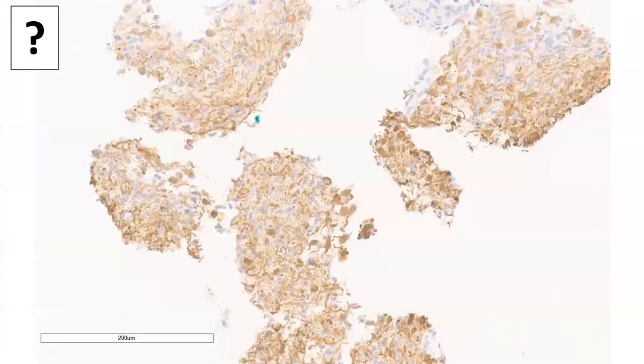Now, here is the immunomarker of the week. Anyone want to unmute and tell me what you think this marker is? It's lighting up the gemistocytes. See all the spherical bodies that are positive? Those are the gemistocytes labeling strongly with the antibody of the week. Somebody unmute and take a shot at it.